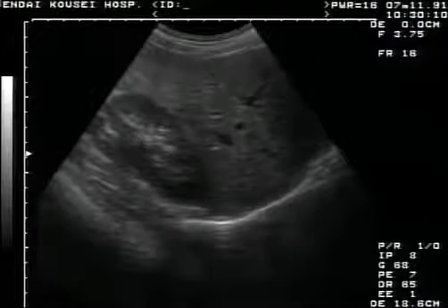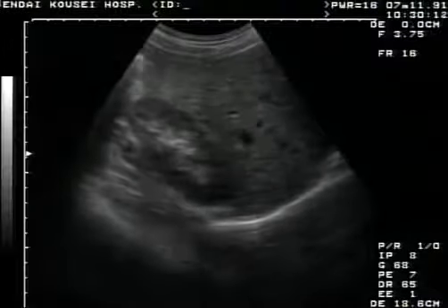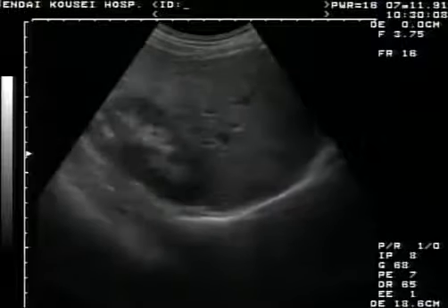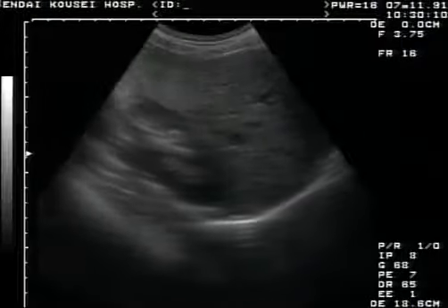The fatty liver includes a brighter area produced by the echo from the hepatic parenchyma. This deviation in echo levels is referred to as hepatorenal contrast.